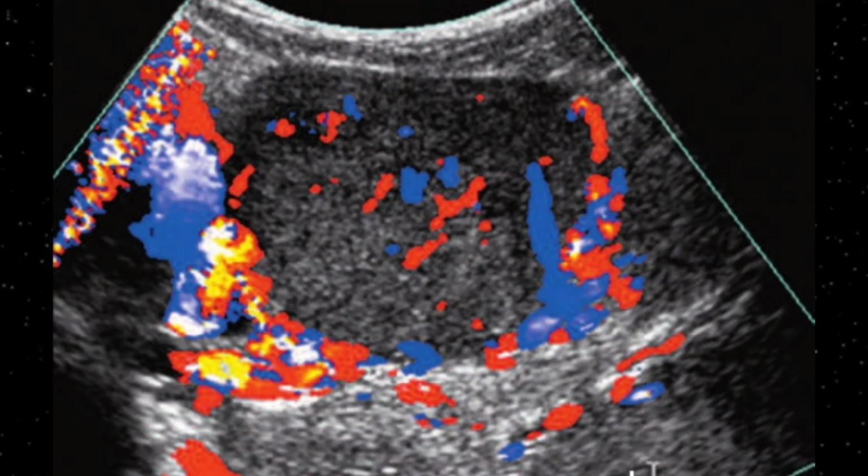So here you have to pay attention to pick the point for the dysgerminoma. Whenever you do a transabdominal scan, you will come across this type of feature, and this would be quite confusing with a fibroid, because a fibroid also appears in this way. Whenever there is confusion, look for the landmark of the uterus. If the uterus is visible and it is separate from this lesion, then look for the ovaries, search for the ovaries. If ovaries are there, and you can pick something within the ovary, then this would definitely be an ovarian lesion.